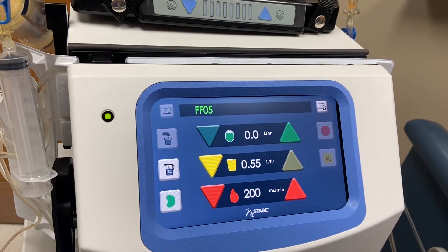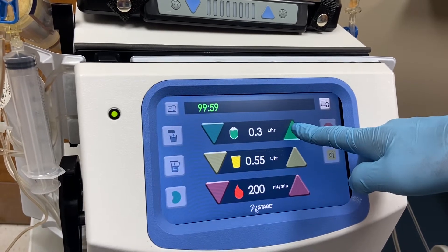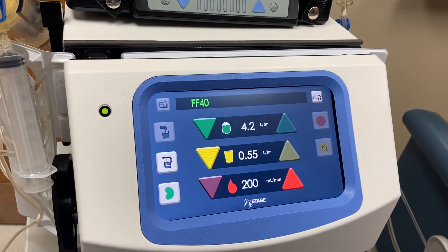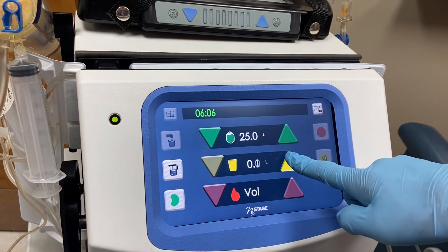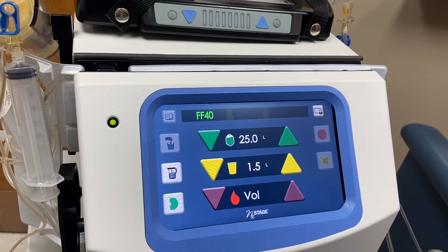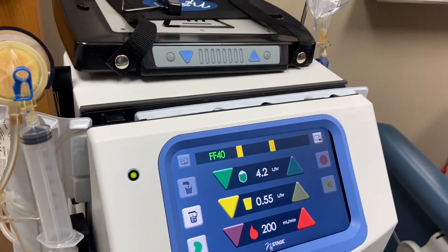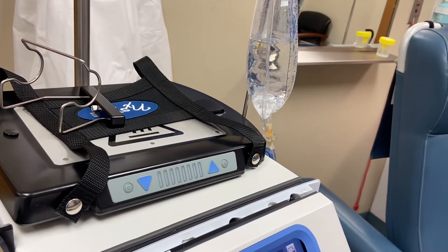Your green setting is your dialysate — set it to whatever number the machine will allow for now. On the second page, we will set removal to 1.5. Go back to the first page.